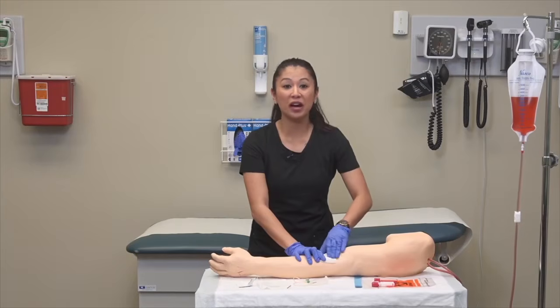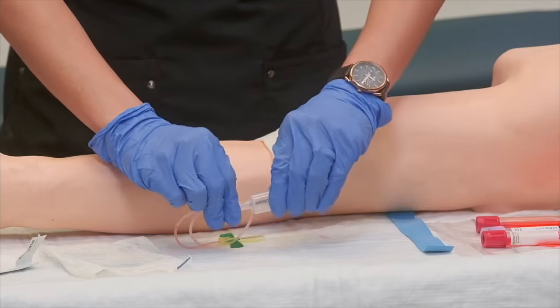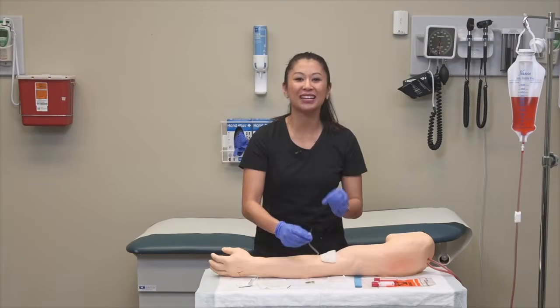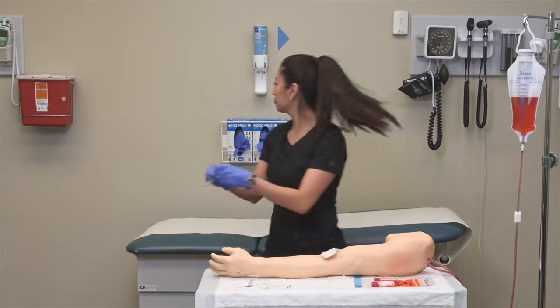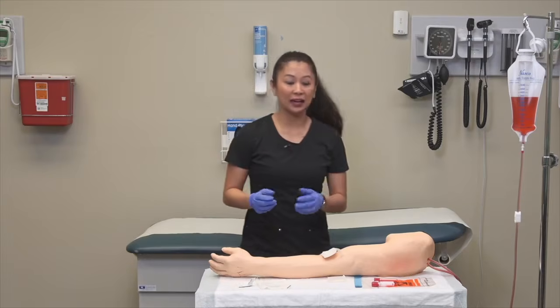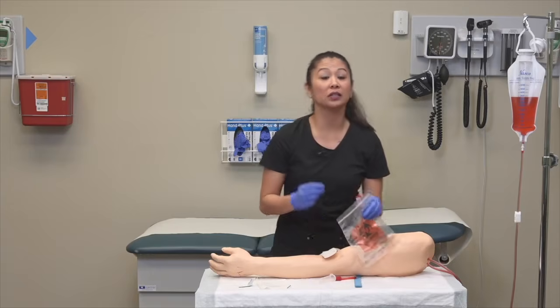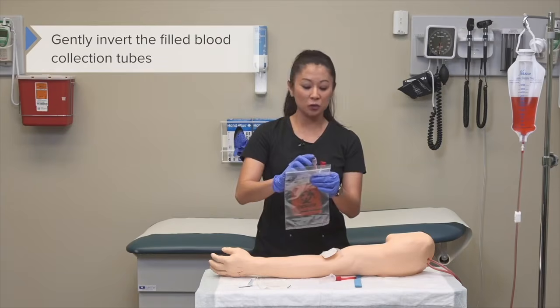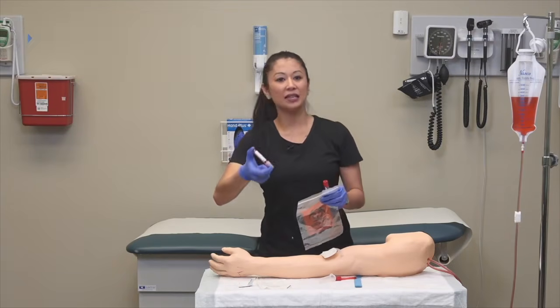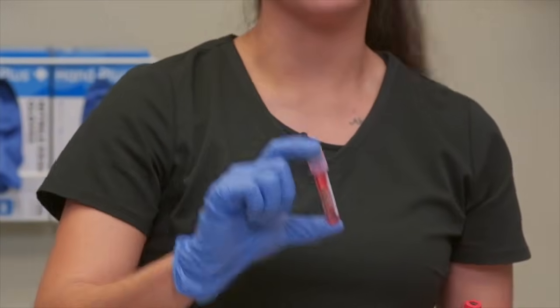Okay, so now that we've got this down, just remember that you want to take your needle here, and we can remove it from the blood collection device and place this into the sharps container. Now once we've done that, it's a good idea that we gently invert our blood collection tubes. So when we do this, we don't want to shake this. We just want to simply take this and gently invert it to mix the blood with the tube's additives.